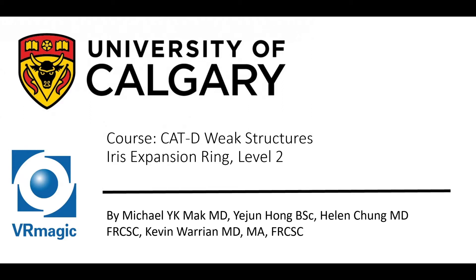Hello, my name is Dr. Michael Mack. I'm one of the residents here at the University of Calgary, here to explain to you cataract D-weak structures, iris expansion ring level 2.